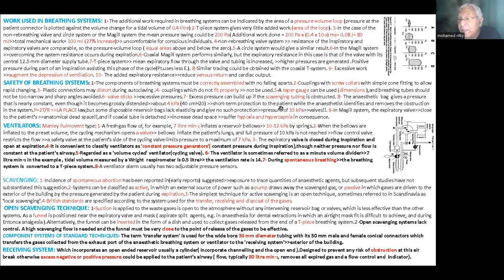The scavenging system, which is taking the exhaust outside, can obstruct and affect the airway of the patient, inducing a pressure.